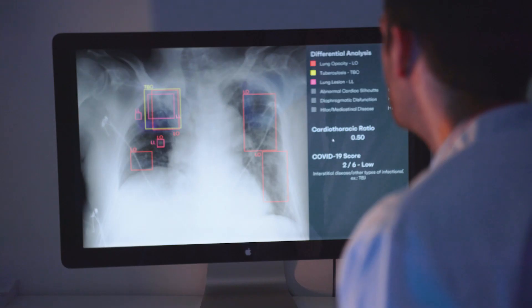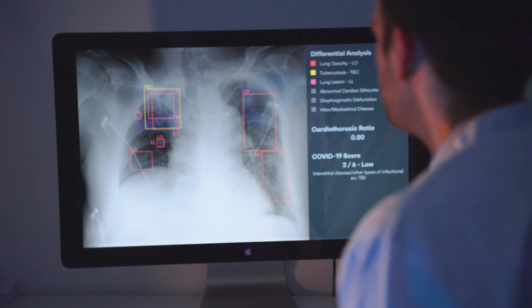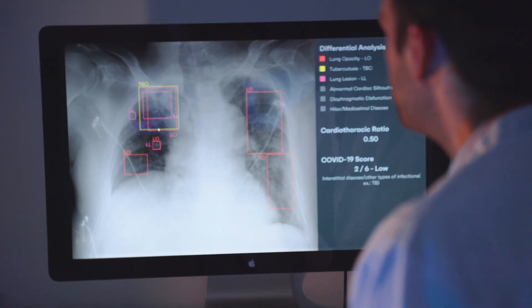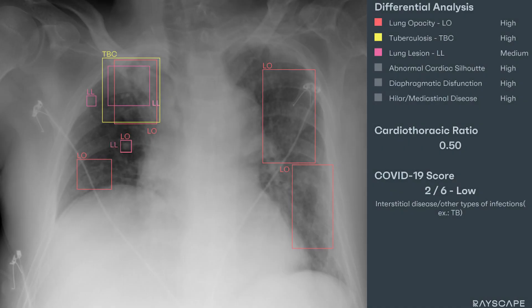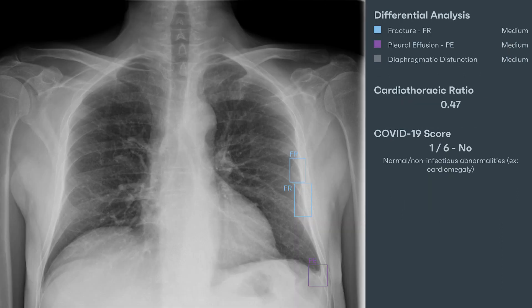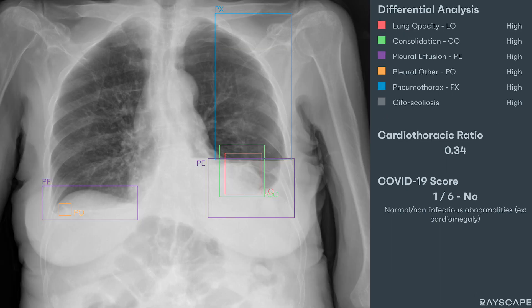We go the extra mile to stay on top of industry trends and technologies with the sole purpose of allowing radiologists to become faster, better, and more accurate in diagnosis. Our chest x-ray analysis product is designed to offer radiologists a 360-degree view of the patient from a single x-ray investigation in the shortest amount of time.